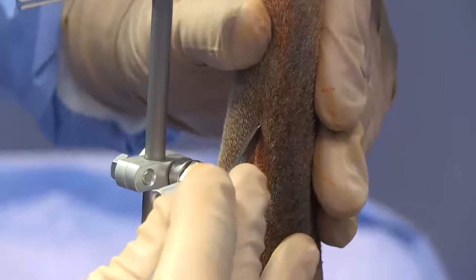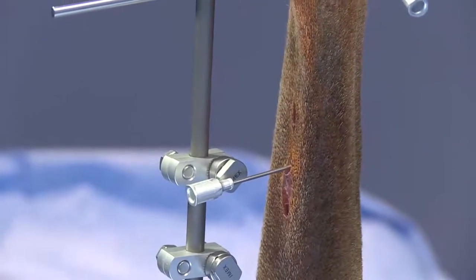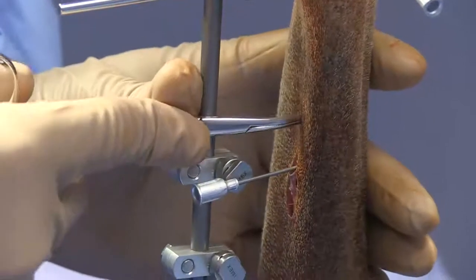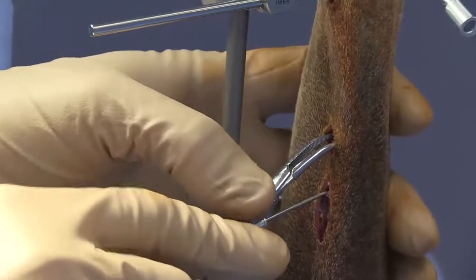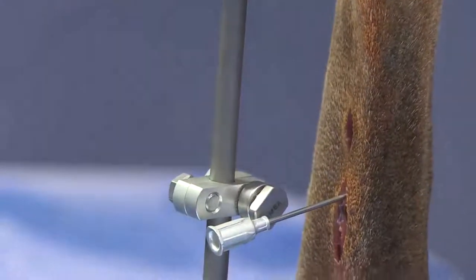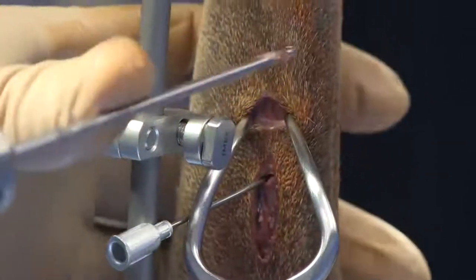We'll go ahead and make a releasing incision about a centimeter distal to that fracture site. We've got hemostats here to go ahead and develop our soft tissue plane again. We've got a great view of that bone right there and we're in good position to now place the next drill hole — you can see the bone right underneath there.